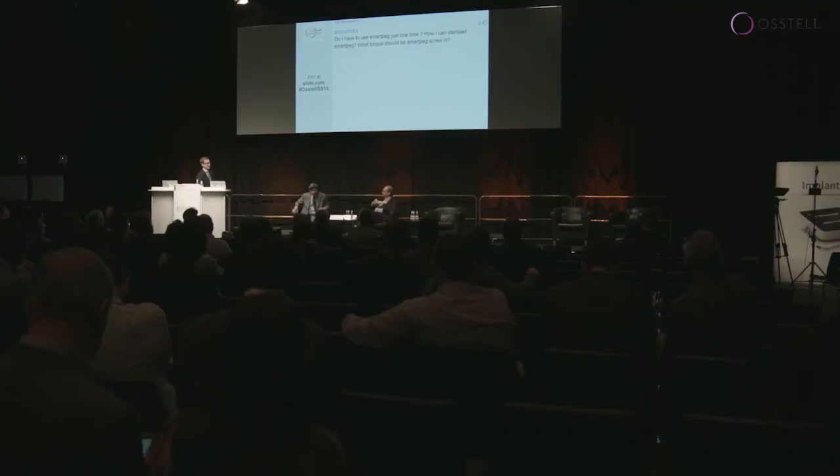The SmartPeg we are using several times in the same patient, so the consecutive readings are done with the same SmartPeg. We all know that you cannot really sterilize it. Also, you could sterilize it in steam, but then the process is more expensive than the SmartPeg. So we use just one SmartPeg in that patient, disinfect it and put it in the chart, and when he comes back at 8 weeks, I use the same SmartPeg again, and then we throw it away. Okay. That's how we do that.